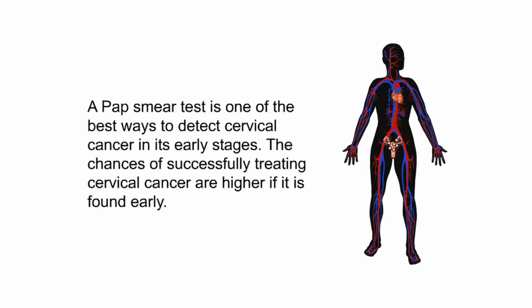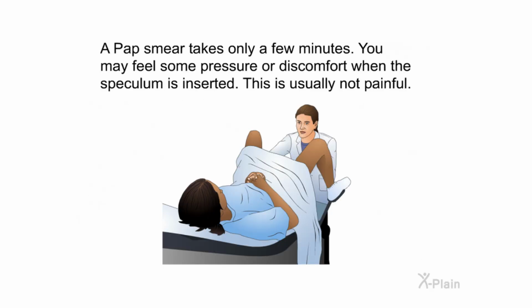A Pap smear test is one of the best ways to detect cervical cancer in its early stages. The chances of successfully treating cervical cancer are higher if it is found early. A Pap smear takes only a few minutes. You may feel some pressure or discomfort when the speculum is inserted. This is usually not painful.